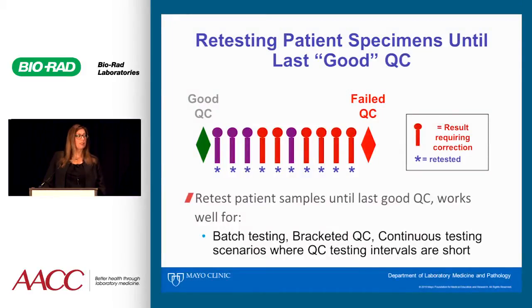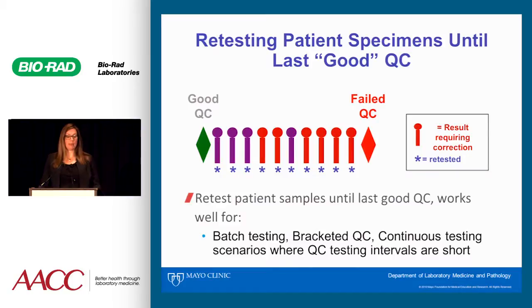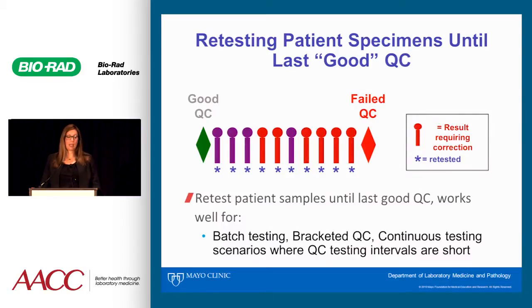Retesting patient specimens until the last good or in-control QC is pretty straightforward. Here I've shown good QC with a green diamond, and the failed QC at the next measurement is the red diamond. In between, each stick figure might represent 2, 10, or 20 patient results. Because we had a QC failure, we've gone back and repeated all of the patient tests, and the red ones are the ones that had to be corrected.